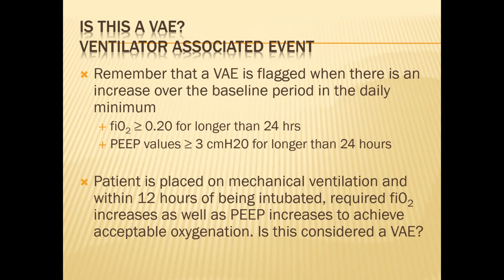Is this the last one? So is this a ventilator associated event? It tells you to remember that a VAE is flagged when there is an increase over the baseline period and the daily minimum, and it's FiO2 and PEEP.